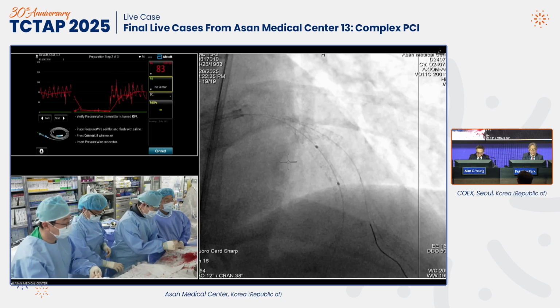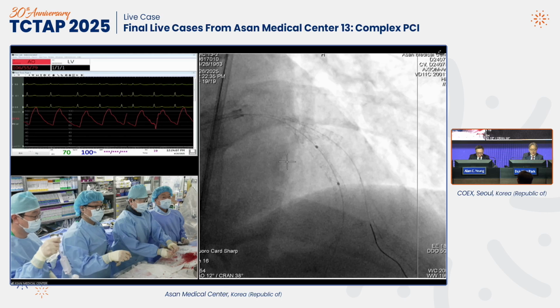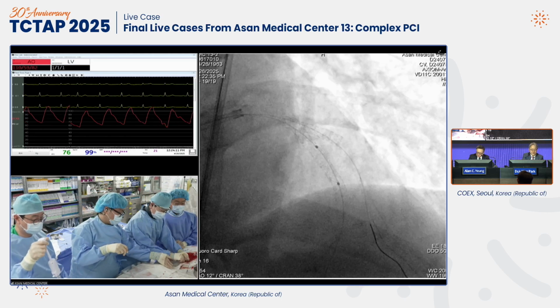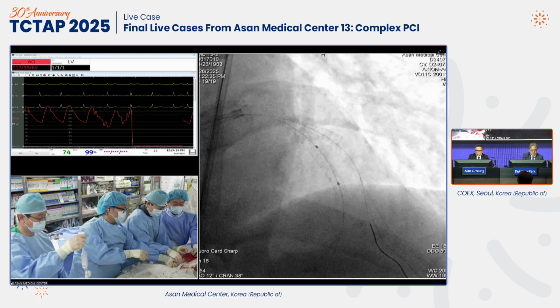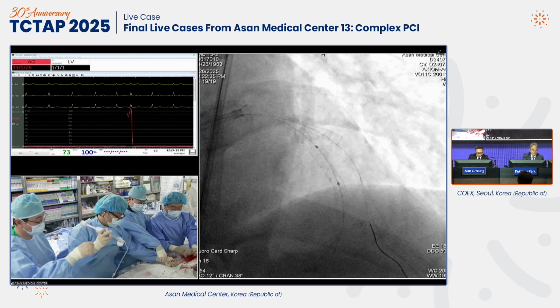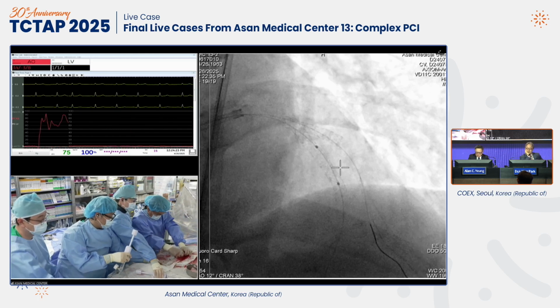Okay, 3.25. Okay. Can you see it? Yes. All right. So we are still a long way to go. It's pretty simple, focusing regions. However, okay, we're gonna do.